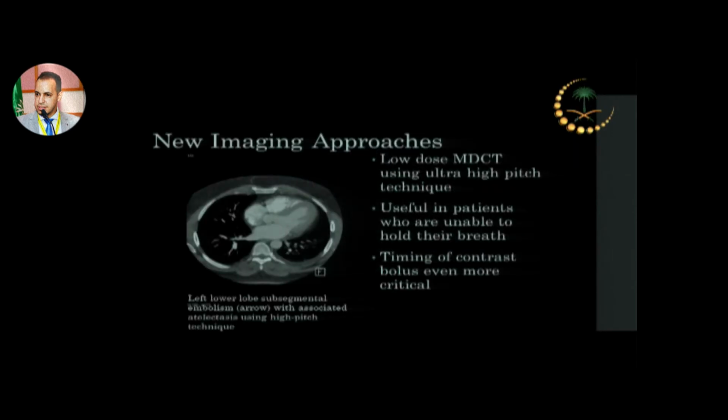This is a patient who has a tiny left lower lobe pulmonary embolism. The scan was done as an ultra-high pitch technique, which is much faster than the conventional imaging.